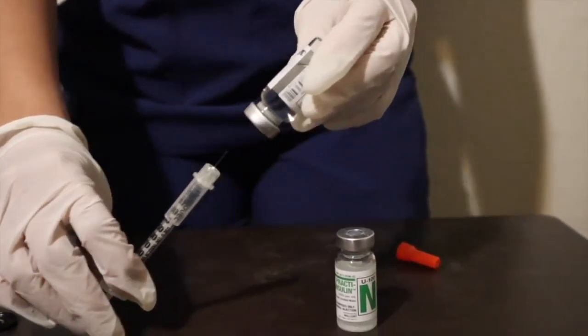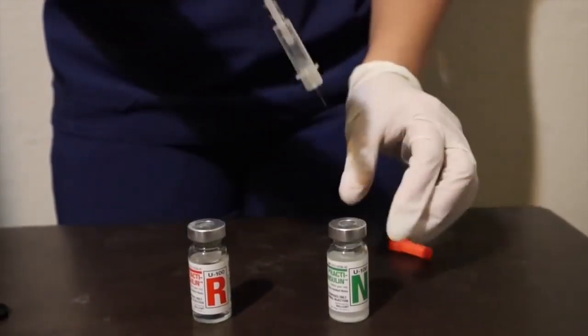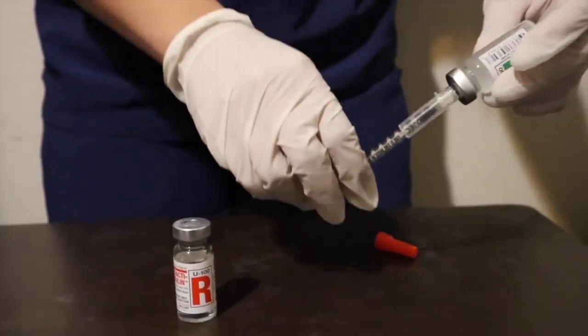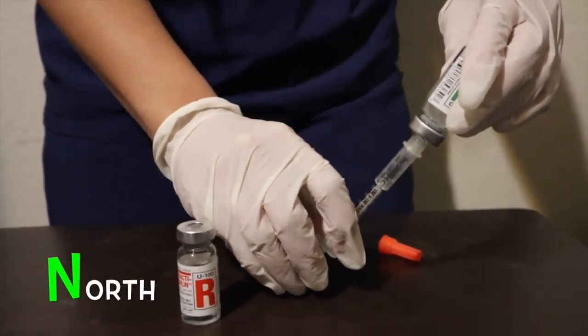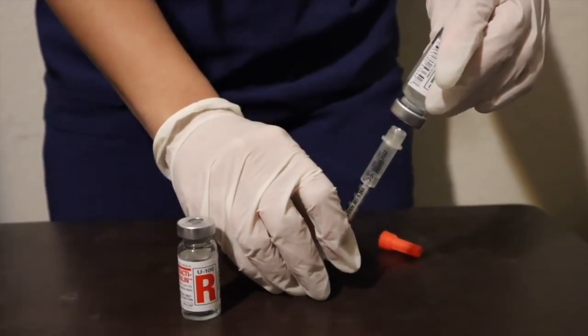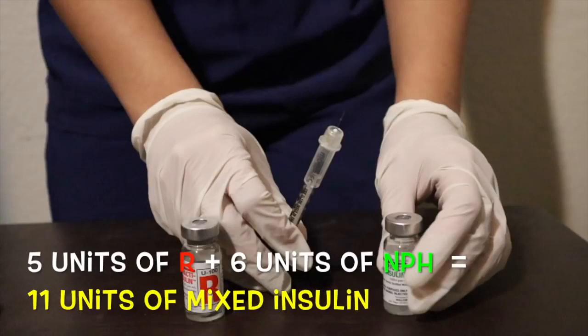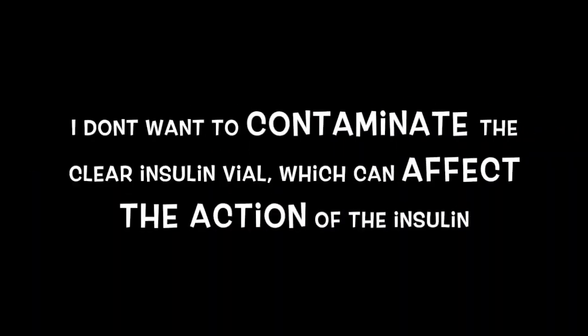Then pull out your needle. Inject the NPH vial, turn it upside down, and pull out six units of NPH. That is the N in the 'north' part. This mnemonic ensures that I draw the clear first before the cloudy — regular before NPH.